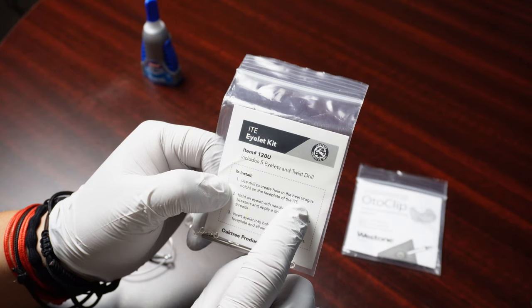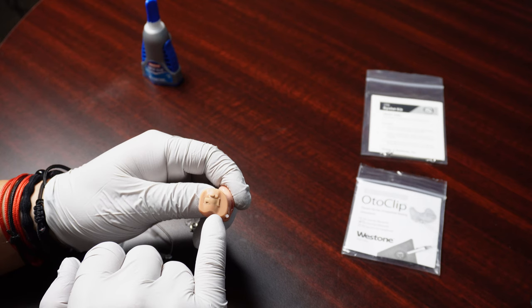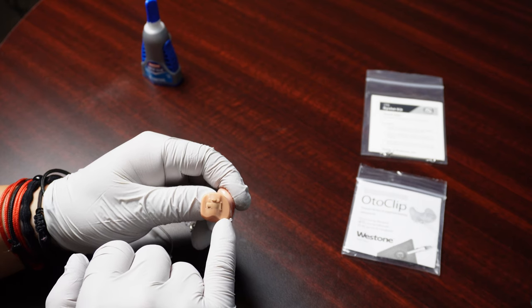Number one, make sure that you have enough room on the faceplate. This is the faceplate. It is the outside of the hearing aid that is facing away from you, the part that people can see. It's where your battery door is, it's where your microphones are, and if you have a volume control or a program button, that is all on the faceplate, and this is where you're going to be drilling your hole.